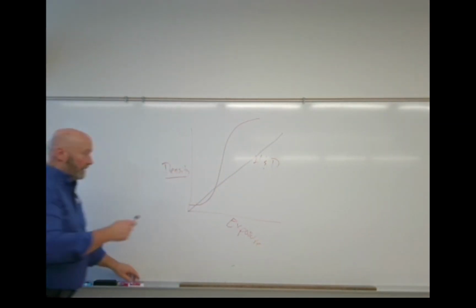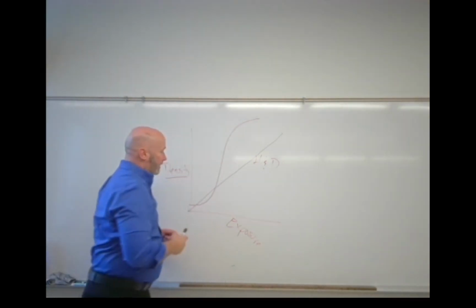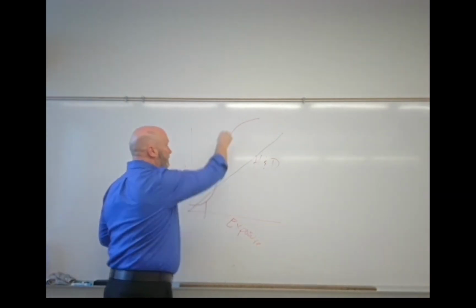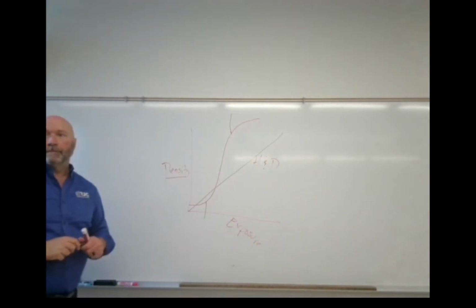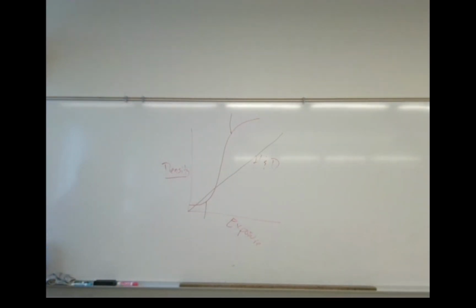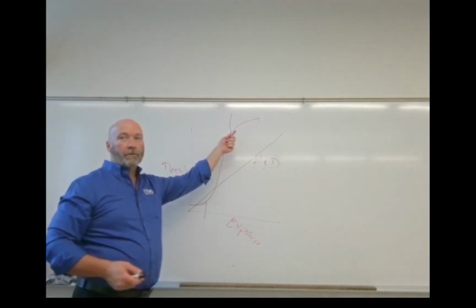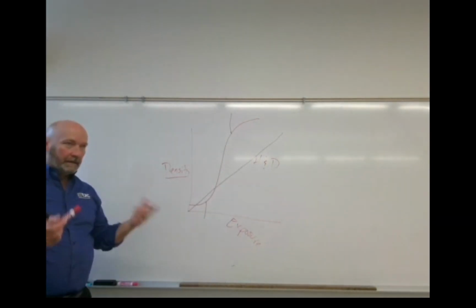So when we have this very vertical H&D curve like that, what it means is we're going from an area that's very light to an area that's very dark with very little exposure in between. Okay, so what does that sound like? Dark or light to dark? Contrast. Contrast, right. So if you go from light areas to dark areas very quickly, then that's naturally going to be a high contrast image.